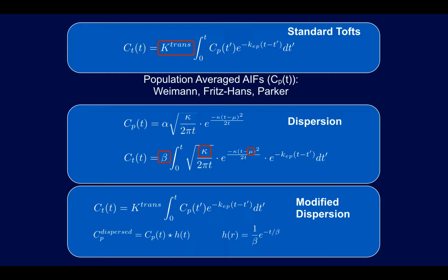So recently we developed a so-called modified dispersion model, which is simplified so that the fitting process could be much more robust. The idea is similar, considering different dispersion factors, but the parameter count is just one, compared to an additional two in this case.